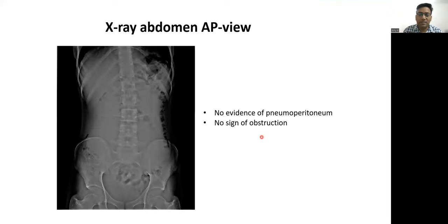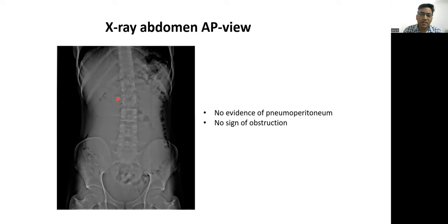Proceeding with the imaging, the first imaging we did was the X-ray abdomen anteroposterior. Grossly, the X-ray abdomen appears normal. There is no gas under the diaphragm, so we rule out pneumoperitoneum. No signs of obstruction, as there is no air-fluid level seen in the visualized bowel. However, there is a mass seen on the right side of the abdomen causing displacement of the bowel loops towards the periphery or towards the left side.